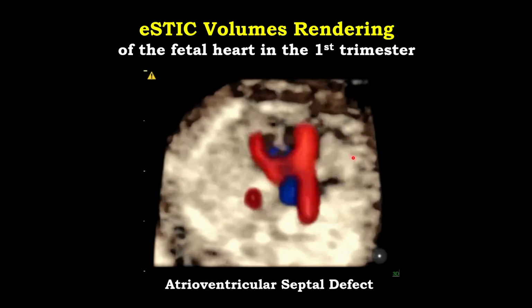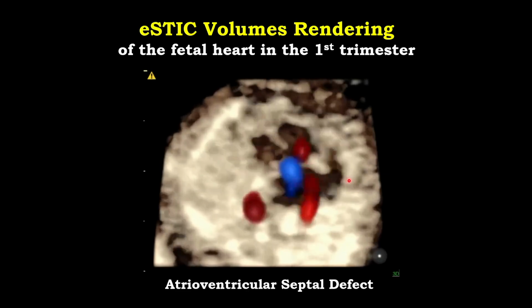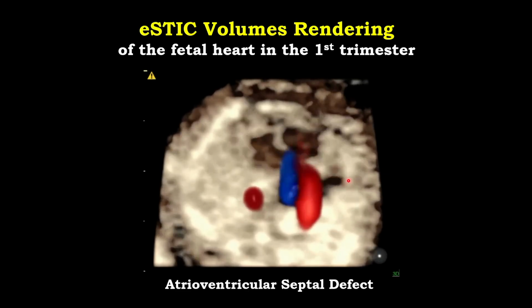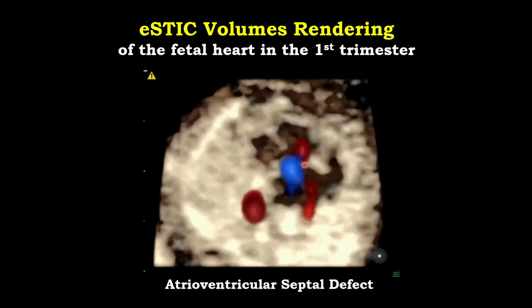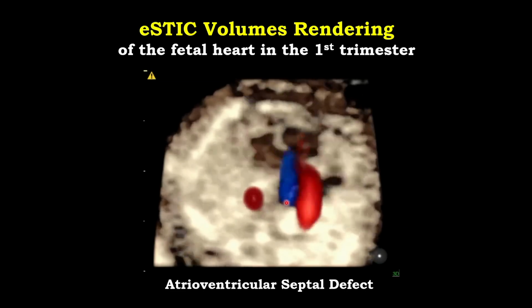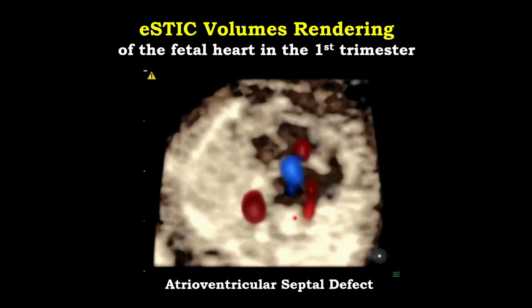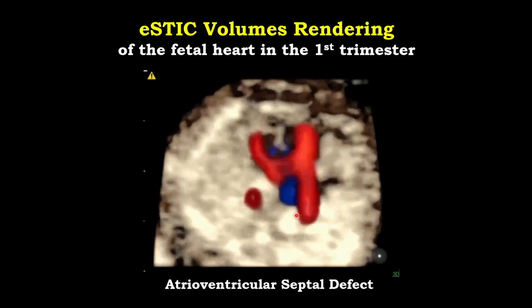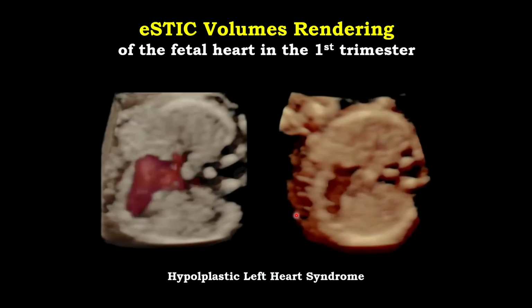This is a complete AV canal at 13 weeks gestation. We can clearly see all the anatomical landmarks of this cardiac defect, but what's really remarkable, we can visualize the central regurgitation at that AV valve, so pretty much implying that the crux of the heart is abnormal. We can get more confidence when we are looking at the major problems with the heart, in particular univentricular hearts.